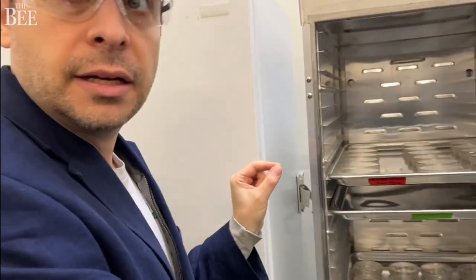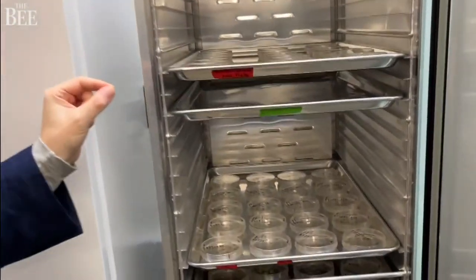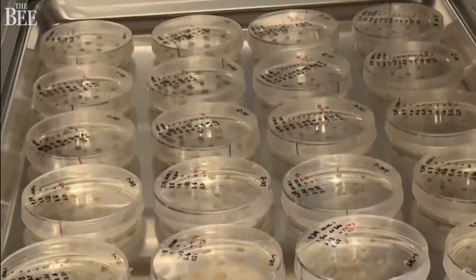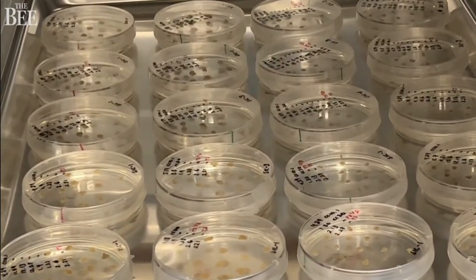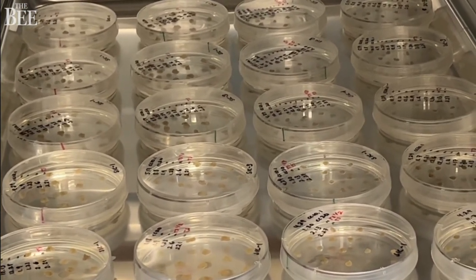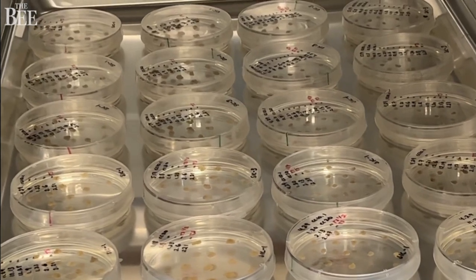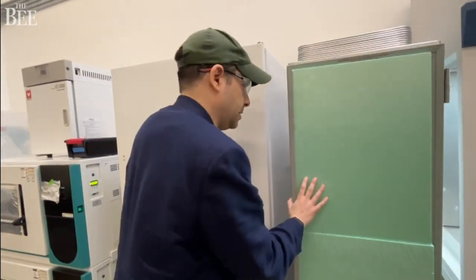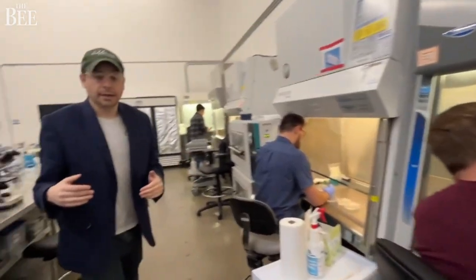We start off with a little cutting from a piece of cocoa and putting it on a plate with sugar and different plant hormones. We're able to get them to grow, divide, and produce these complex cocoa flavors. And this is basically the first part of the development. As the cells get mature and grow, we then have to select them.